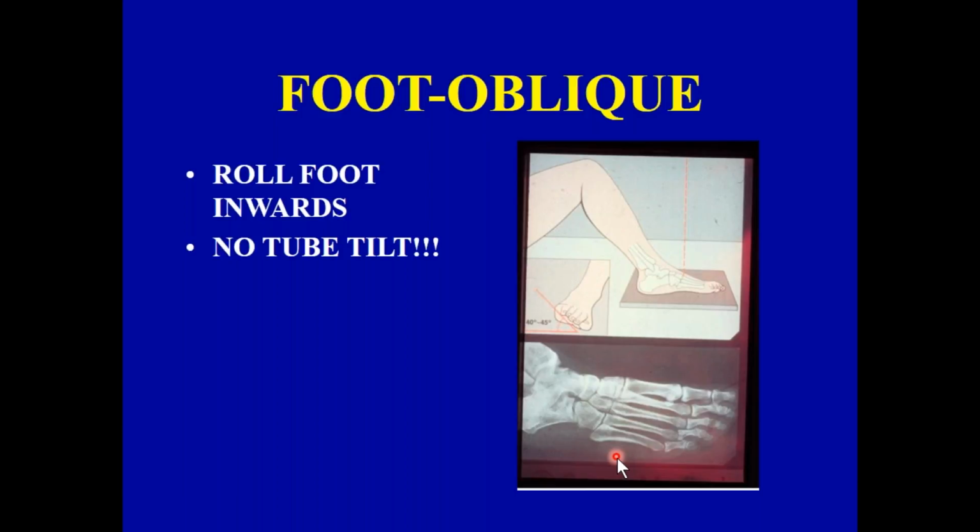So if the patient's clinical history is, I dropped a kettlebell on my foot when I was at the gym. I was visiting a good friend of mine who has a horse farm, and the horse stepped on my foot. I was dancing and my clumsy partner stepped on my foot with his cowboy boot. I now have a bruise. It's been hurting. Those are clinical scenarios where you'd be asked to do an examination of the foot.